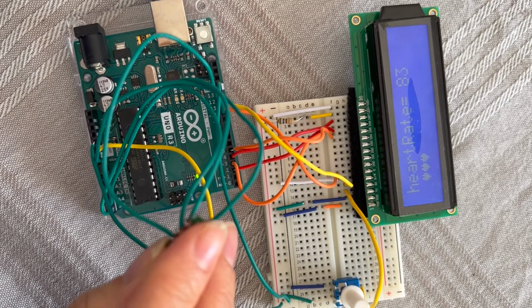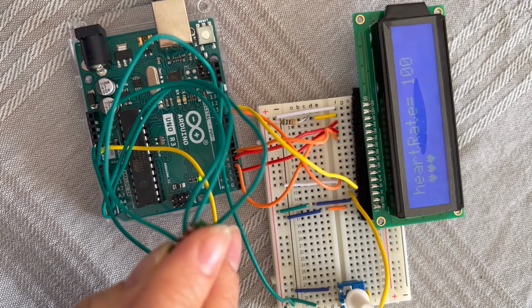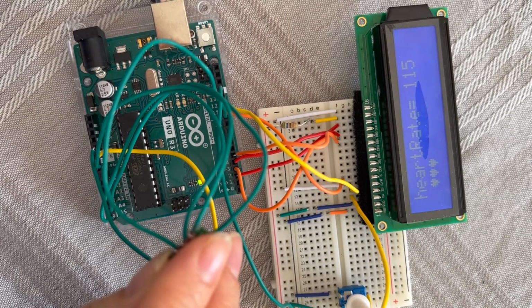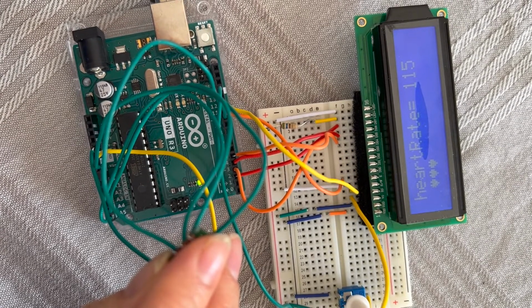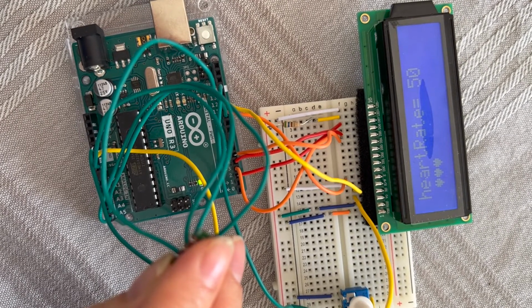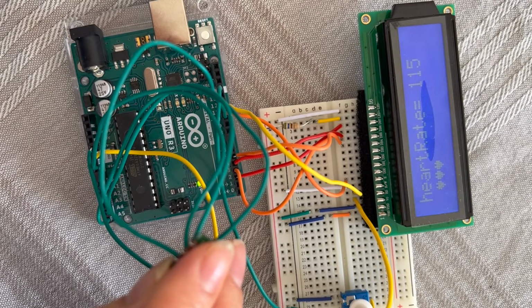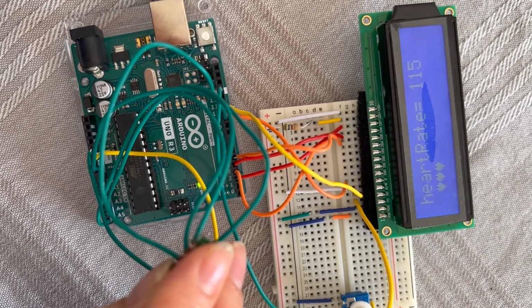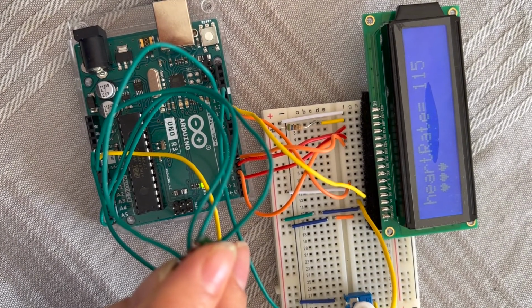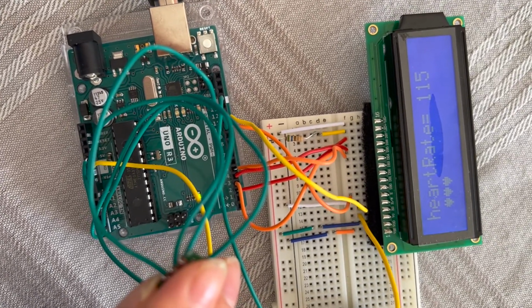So without any further delay, let's just start building the hardware. It will take you around 40 minutes, 30 minutes to just get everything done and see your rate there. It depends on how comfortable you are with the board, but it should be fine. Just follow the tutorial. I will include all the steps in the tutorial, but if you have any questions, just drop a comment. Yeah, so let's build the hardware.